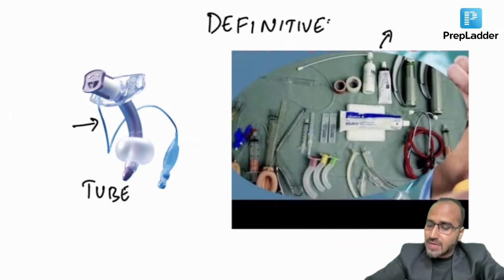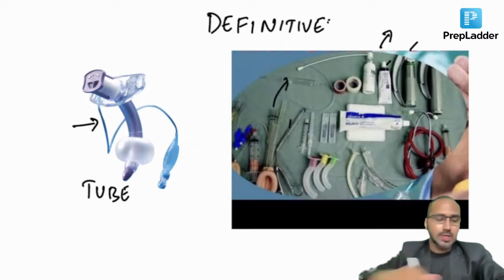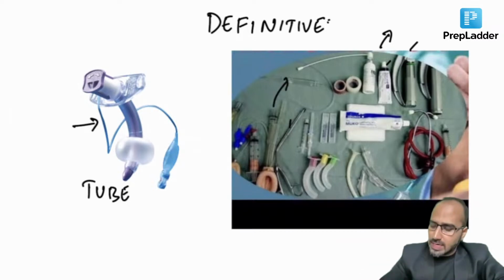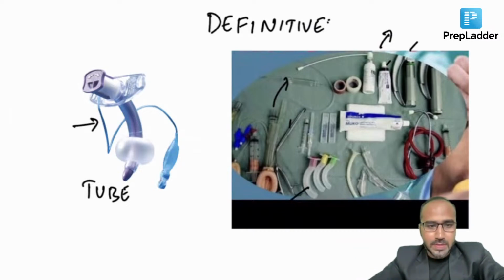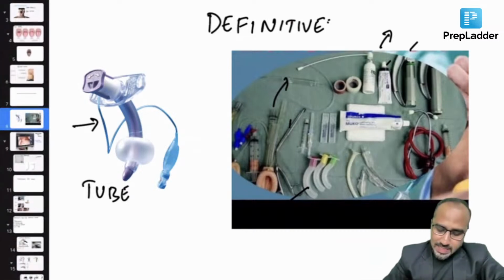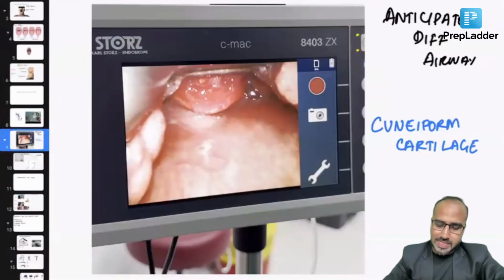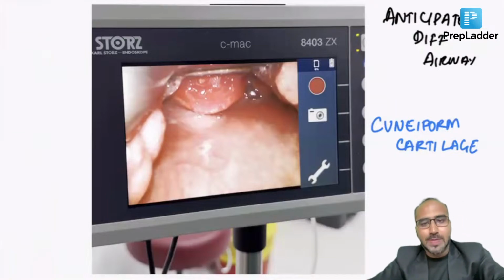And these equipments are basically the difficult airway equipment trolley, guys, where you see the laryngoscope, lignocaine gel, the Magill's forceps, the laryngeal mask airway, Guedel's airway and all. Okay, right. So the question is, can you go for orotracheal intubation? Yes, orotracheal intubation can be done.